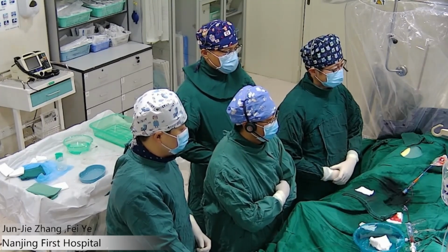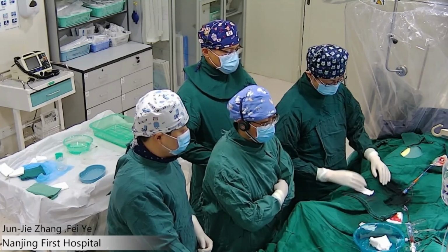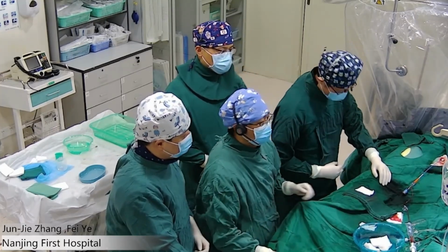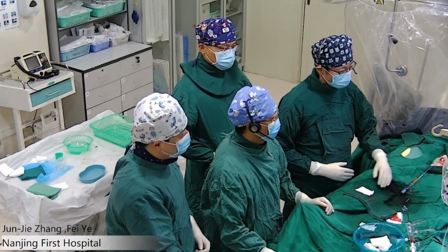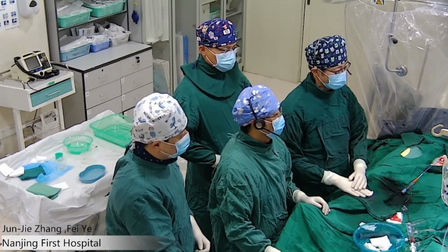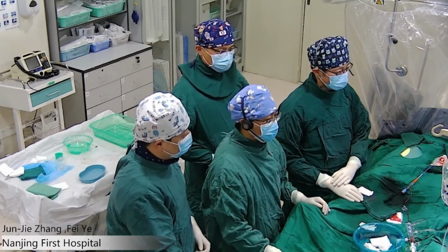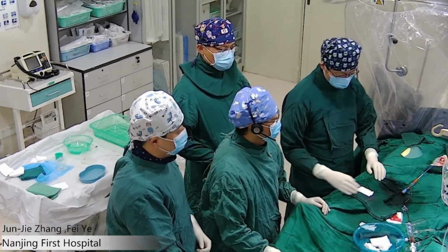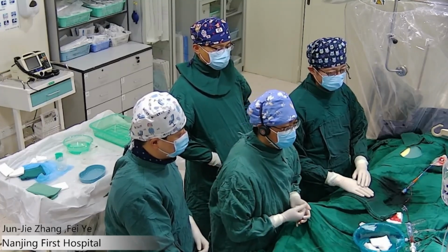The first case operator is Dr. Ye with his team. So please, Dr. Ye, introduce your team and your case. Thanks very much. This is transmission from Nanjing First Hospital. I'm Dr. Fei Ye from Nanjing First Hospital, and today we will perform a case of this left main bifurcation lesion. My colleagues are Dr. Li Xiaobo and Liu Shuiyuan from Nanjing First Hospital. So, Dr. Li Xiaobo, would you please introduce the patient? Please show the slide.